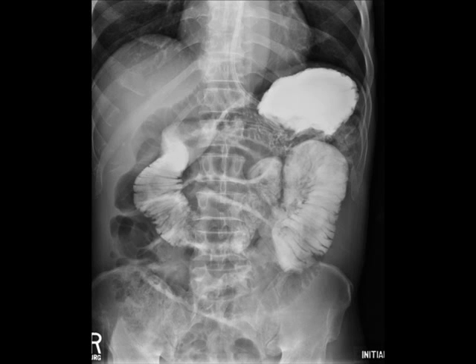Images will be taken for the next hour in 15-minute intervals, and the second hour in 30-minute intervals. At the end of the second hour, or when the technologist feels that the contrast has reached the end of the small bowel, whichever comes first, the radiologist will be called to review the images.